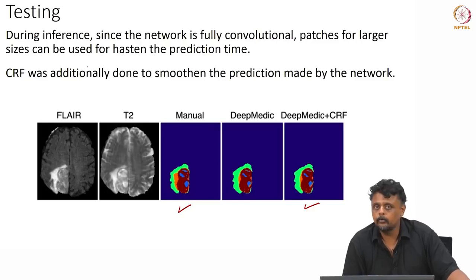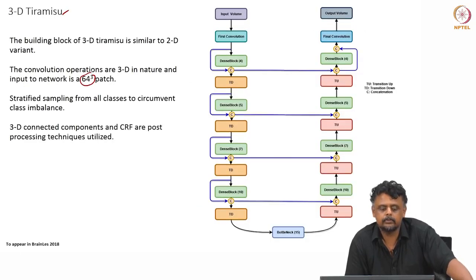So, if you are trying to do a pixel wise classification, you will see that most pixels are normal, right, and a very small percentage of the pixels actually comprise the tumor itself, and within the tumor itself there are these classes which are very underrepresented. Okay. So, these considerations one has to take care of when you train these networks.